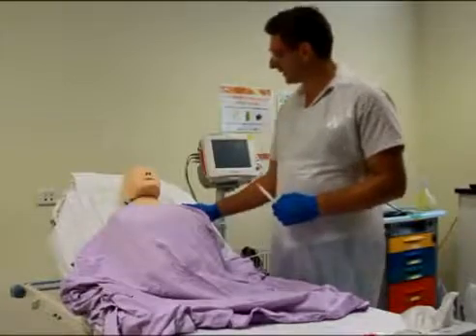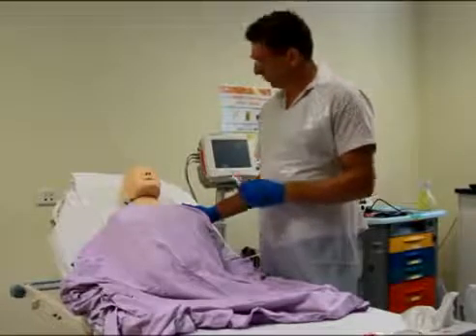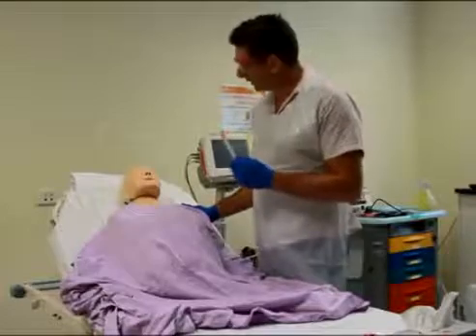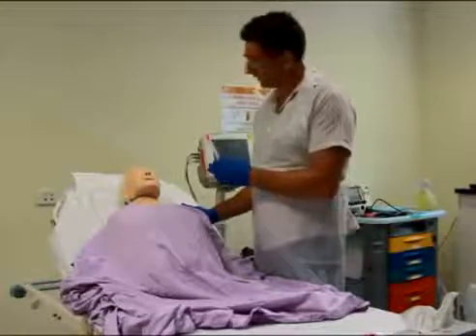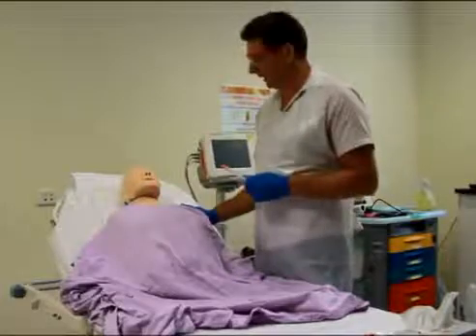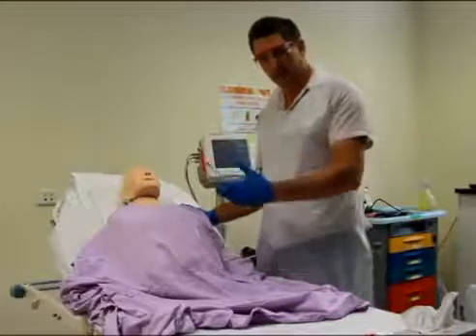I'll come up to Roger and say, 'Roger, we're going to put a tube down the back of your nose — it's going to feel uncomfortable for less than a second, then I'm going to take it out.' So make sure they understand what's happening.